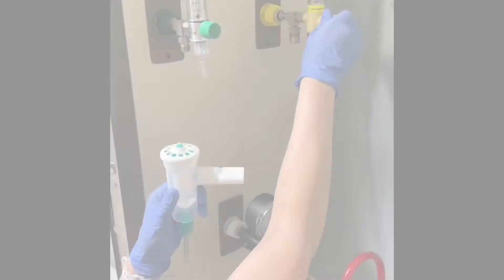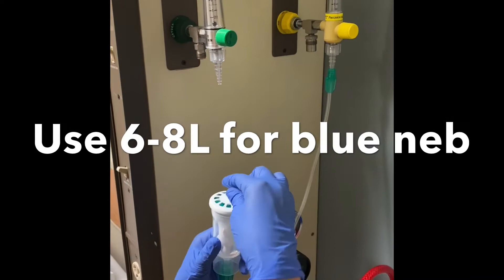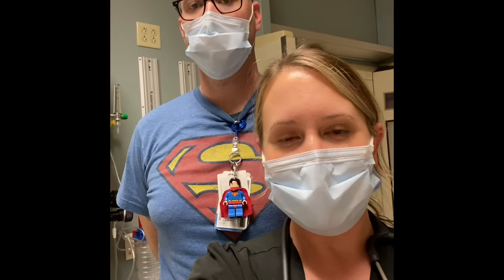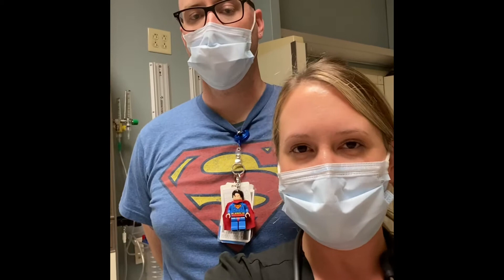Set your flow meter at around 5 liters per minute and make sure to turn the nebulizer on — you'll see the medication come out in a mist form. While the patient gets the treatment, you want to monitor them closely. If their heart rate increases by 20 at any point in time, you want to stop the treatment. Or if the patient begins to feel jittery or anxious, discontinue as well.